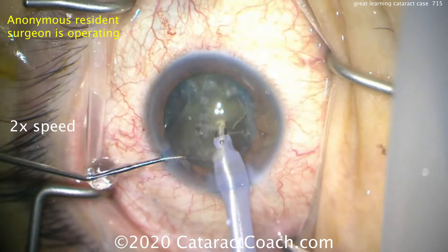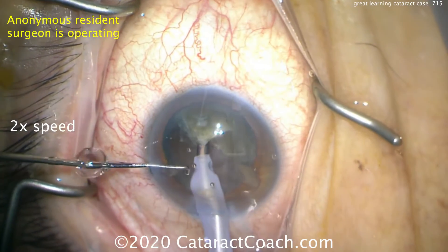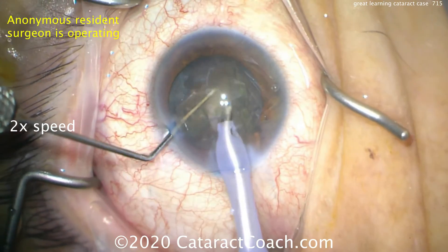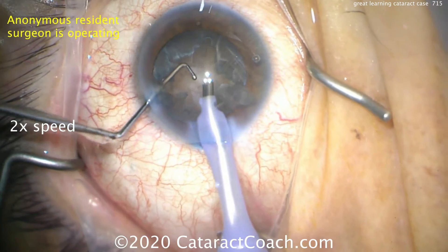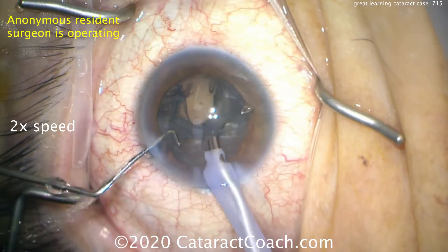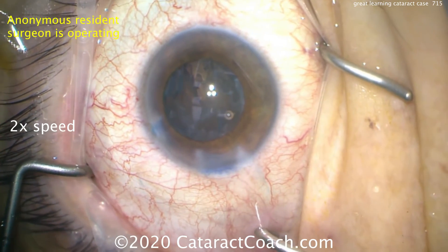Given the larger capsulorrhexis, we were able to bring out part of that nucleus. Now further sub-chopping — the resident is doing a pretty good job keeping the eye in primary position. This patient was given a retrobulbar block for anesthesia, and there's also great draping of the eyelids and lash margin — no eyelashes in the field. Taking away the last few bits of that first half, and then the rest of the nucleus can be fed into the probe pretty easily. That's another advantage of having a generous capsulorrhexis — if you make a baby-sized 4mm capsulorrhexis, it's much harder to bring nuclear pieces out. Now there's an epinuclear shell remaining; the key is to use just vacuum to bring it up, and use the chopper to push it forward. If you can't get it, that's okay — we can just do it with the IA probe.